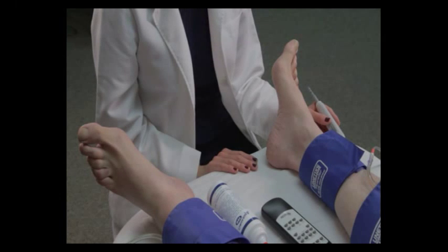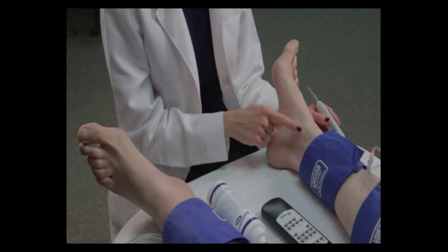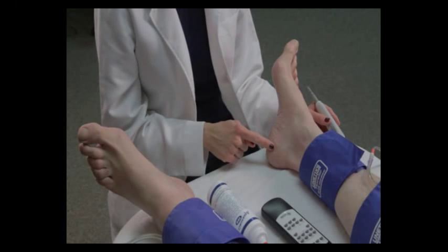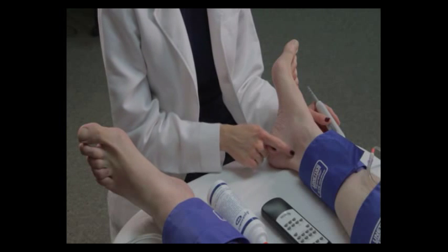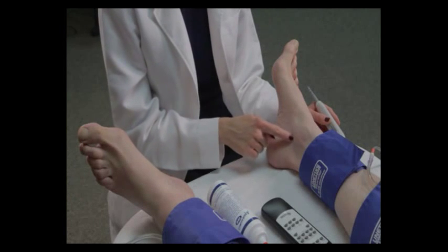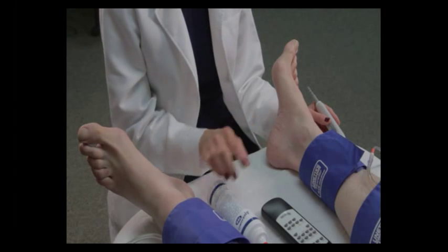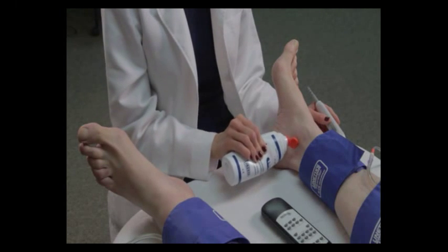The posterior tibial artery can be found near the medial malleolus if you draw an imaginary line between the ankle bone and the heel, and then put an imaginary quarter up against the ankle bone that bisects that line. That's the region where you're going to be finding this vessel. Put a large dollop of ultrasound gel in that area.